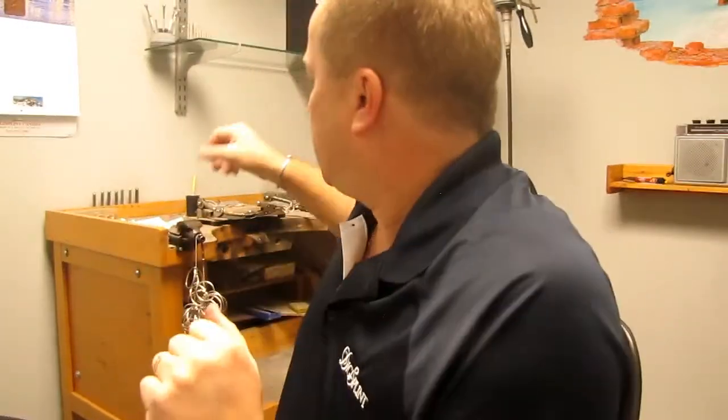The splint I'm going to be focusing on is called the Swan Neck Splint, and how it directly relates to Ehlers-Danlos Syndrome as well as stabilizing joints to make our hands more useful and functional. I'll show you a quick sample — I've got two different versions of it.